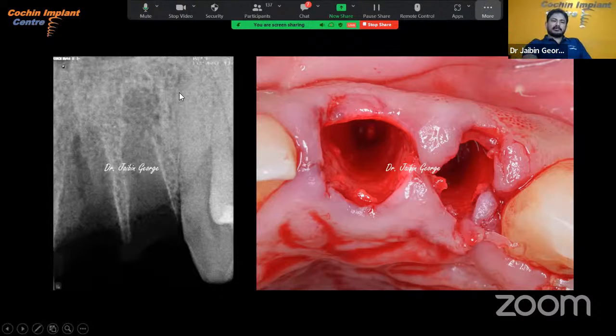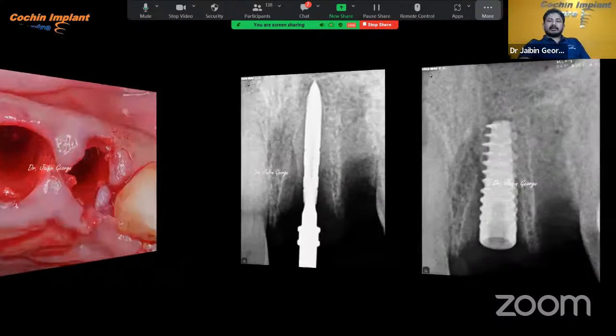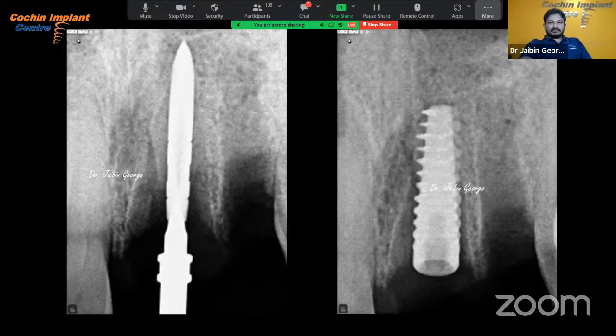And you can see a radiolucency here. That means there is no bone there. So before placing the implant, after curetting the site, I wanted to remove all granulation tissue and infected tissue inside the bone. I removed the granulation tissue and packed a bone graft into the space. I used the Densah drill in reverse mode, condensed it well, then placed the implant.